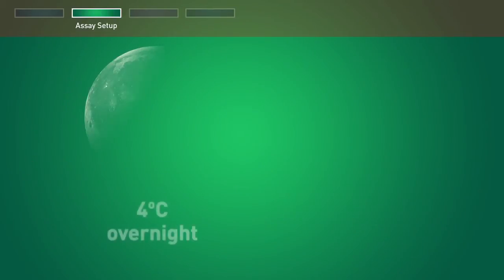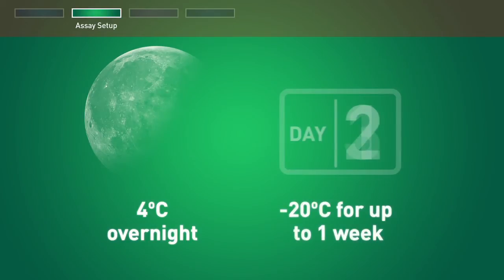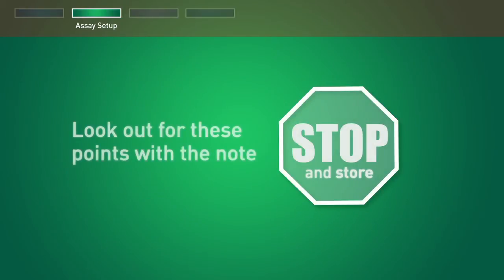At this step, and at the end of each section throughout this protocol, you may cover and store the unused product at 4 degrees overnight or at minus 20 degrees for up to one week. Look for these points with the note: stop and store.